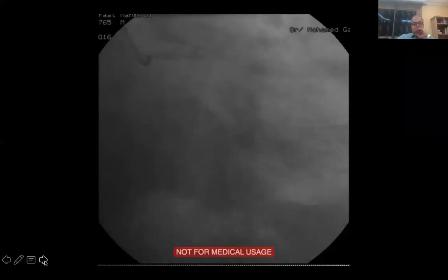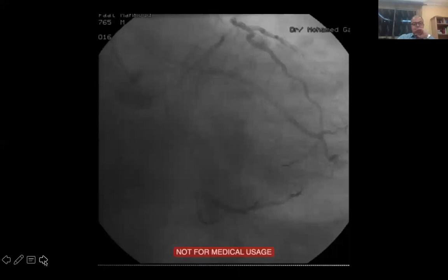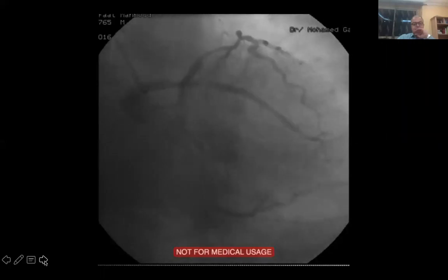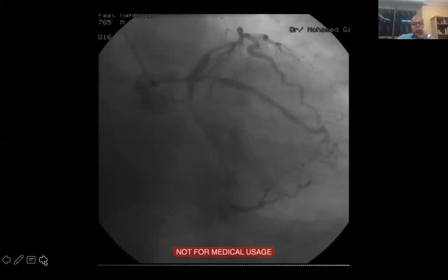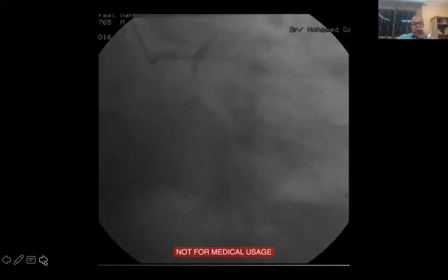If you look at this picture, you can see the plaque in the distal left main. It is impossible to put a stent and avoid any branch. You have to choose which branch you go to with a stent from the left main, to the LAD or the ramus. Which is more important for me? The LAD is very important, the prognostic vessel. So the main stent should be from the left main to the LAD.